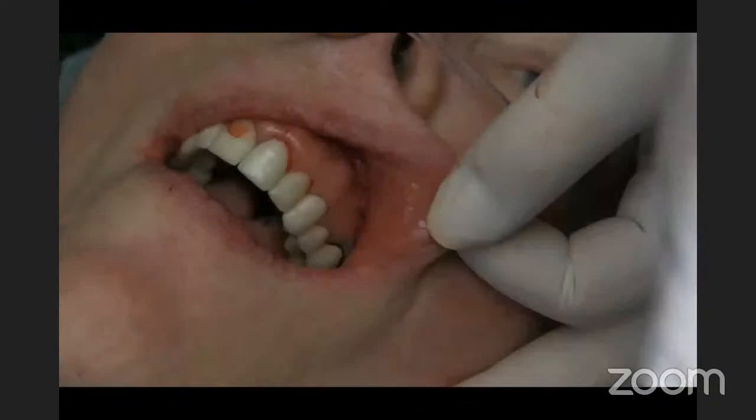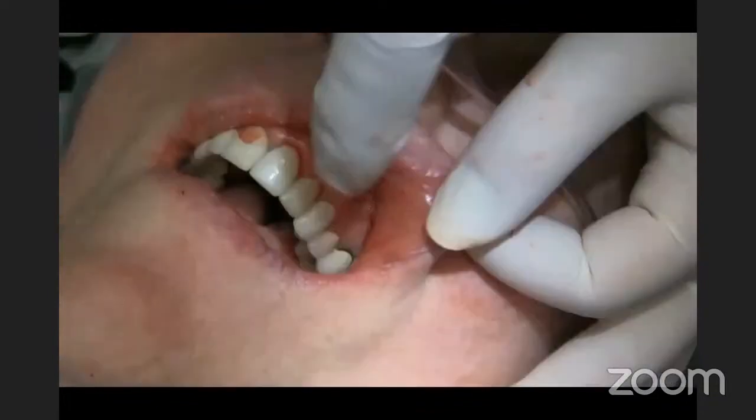I'm compressing the implant to extrude any blood, and standing behind the patient, looking over their forehead to make sure that we have symmetry. And at this point, if I'm happy with what I'm doing, I place several gut sutures, and I don't want this totally tight, so I do want to allow some drainage. It takes about 10 minutes per side to do these implants with experience, and that's how we do it.